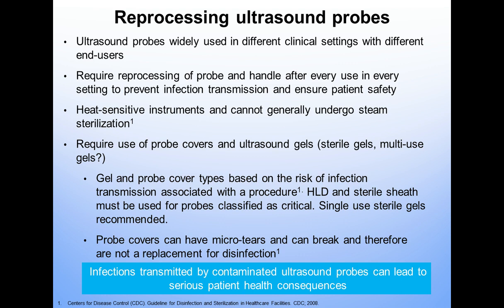Reprocessing ultrasound probes also requires the use of a probe cover. And you also need to use ultrasound gels, obviously, to assist you with providing patient care so that you're not causing too much discomfort, and also to aid in the picture that you will get on your ultrasound video machines.